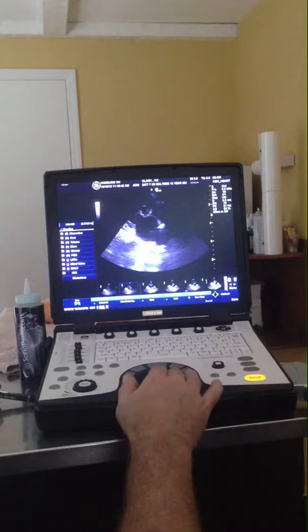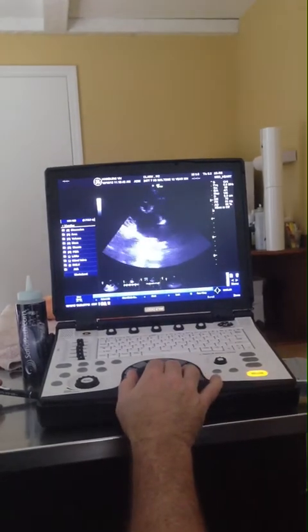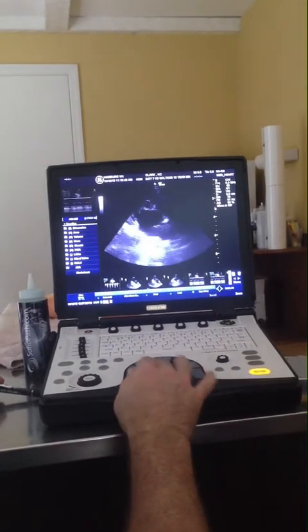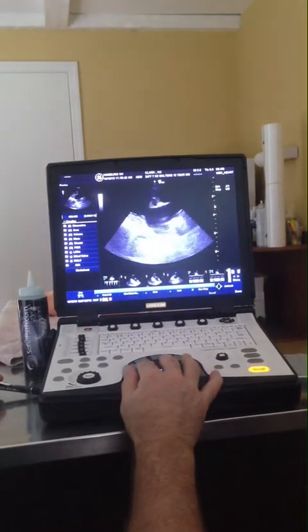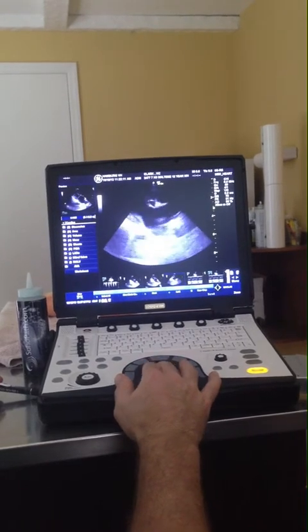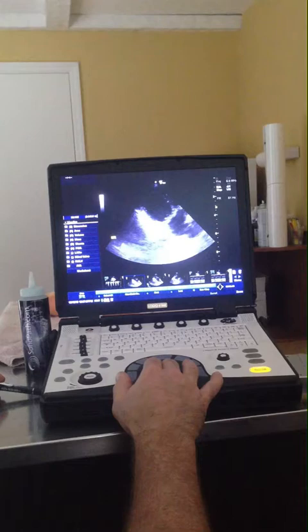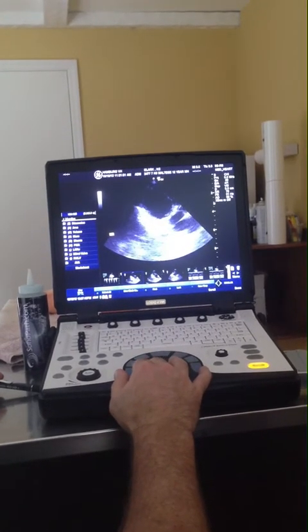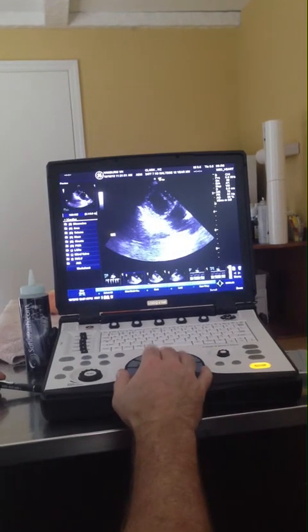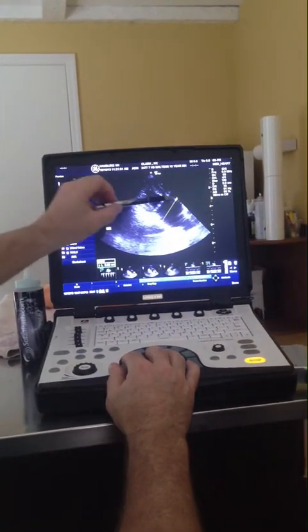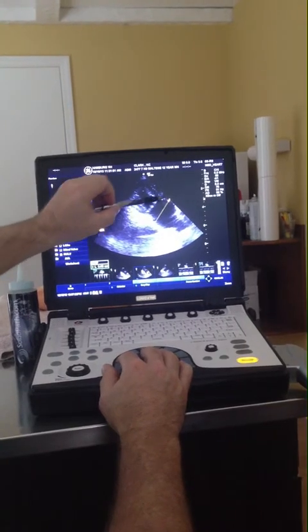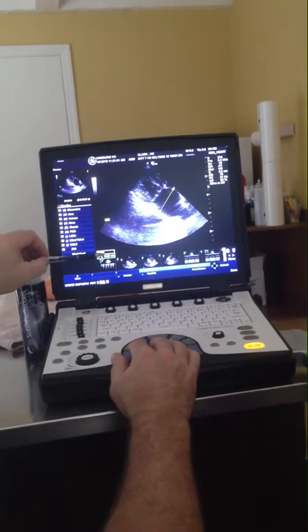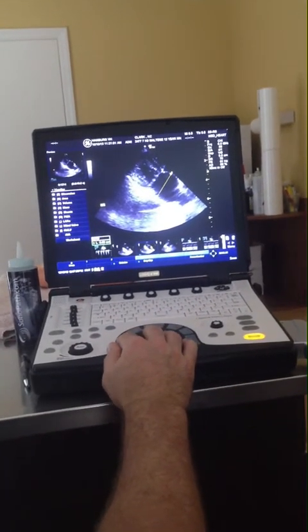Our last measurement is heart base LA to AO. Here's another LA max we can use in a different position — atrial septum to free wall, parallel with the mitral valve annulus. It's a slightly different position and gives a smaller measurement.